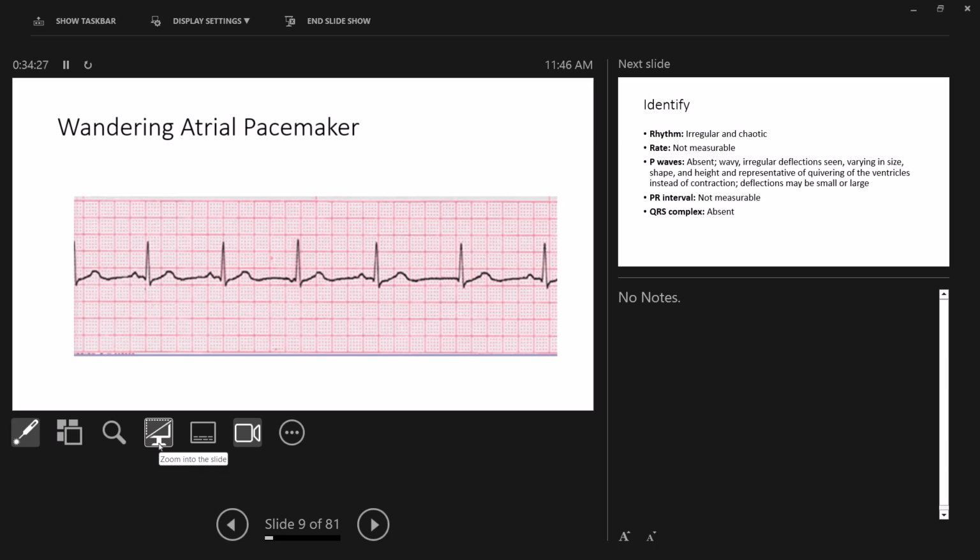But then again, we've got this one right over in here. So that's a third different looking one. And then we've got this one here. This one's more rounded. These all tend to be pointed. So a normal P wave still counts as like a different P wave.